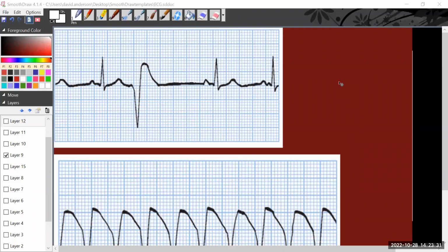Okay, so in this picture, what we're looking at the top is what are called premature ventricular complexes. Remember, we said with premature ventricular complexes, we're getting a normal sinus signal. So our pace is okay. That's what in our picture here, we would have our P wave.